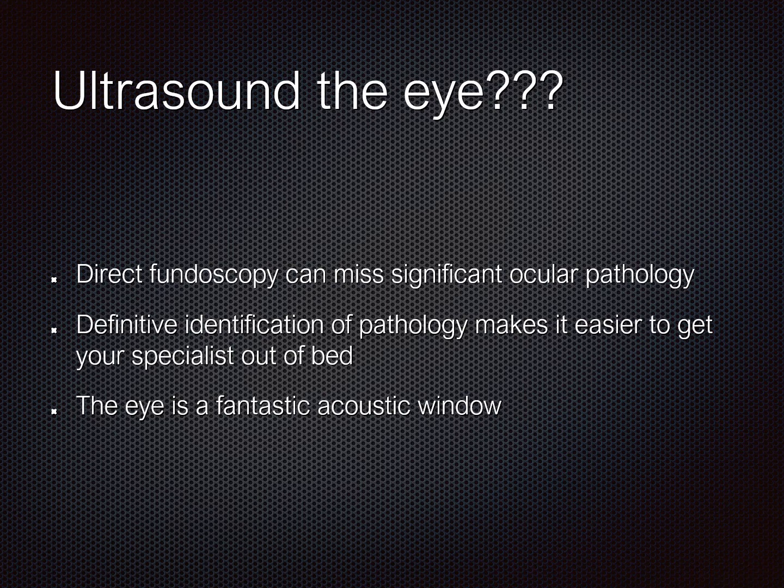A few reasons. The traditional way of visualizing the back of the eye that you've learned about is direct fundoscopy. You learned about it in medical school, and you basically never do it again. It requires that you dilate the eye, which is not something we usually have time for in the emergency department. And if you don't dilate the eye, it's not a very good test, and it misses a lot of ocular pathology. And it's just not really something that's in the scope of emergency medicine.